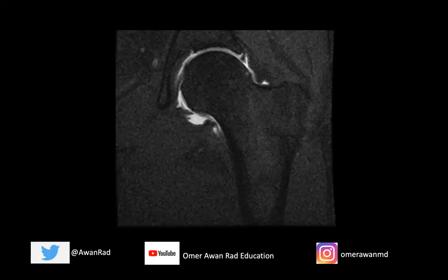Hello everyone and welcome to week 19 of MSK unknown case series. We have a great case today. You're looking at a coronal T1 fat sat weighted image of the left hip, and this is an MRI arthrogram. We've injected under fluoroscopy dilute gadolinium contrast, so we see contrast distending the left hip joint space, and we do that typically to evaluate for labral tears.